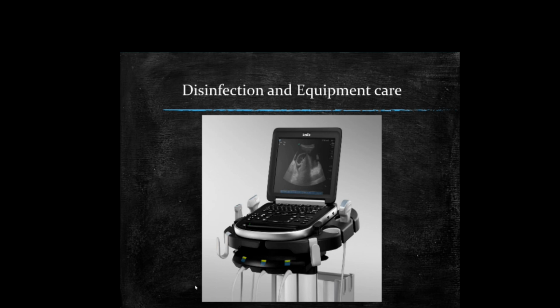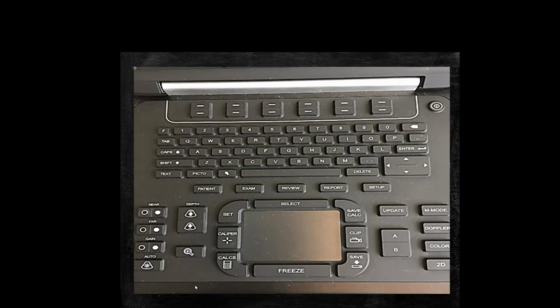Real quick note on disinfection and equipment care. Generally at OHSU, the preferred cleaning solution is the Oxivir TB wipes, but just always check with your local infection prevention control department if you have questions about what is fine to use.